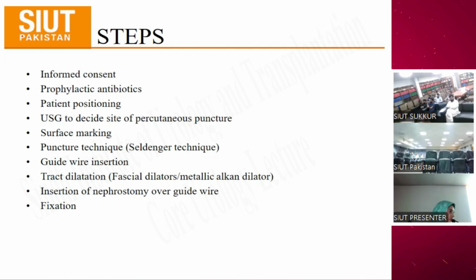Seldinger technique is not that, because once you puncture an organ, for instance a kidney or pelvic system, if that hollow needle hasn't got an apparatus through which you can place something in, then you can only suck some object, but you can't introduce another object. See, there has to be a two-way mechanism. For instance, you access the pelvic system with a needle, and with that you go to an area where there is fluid or pus, and you check whether you have entered the correct place or not.